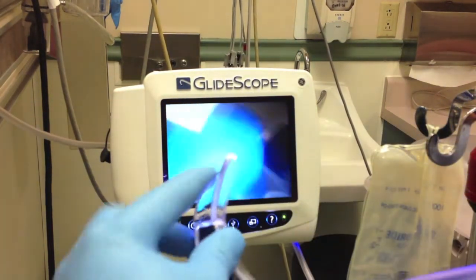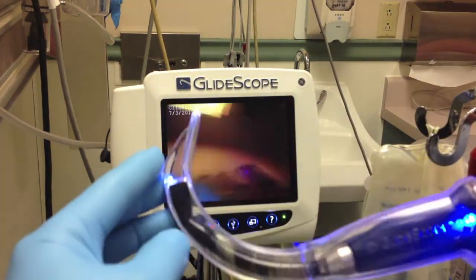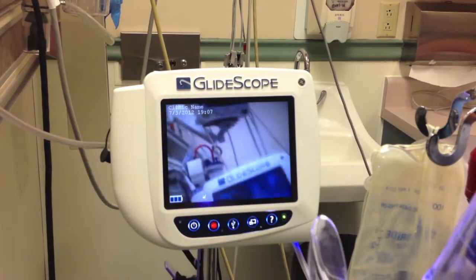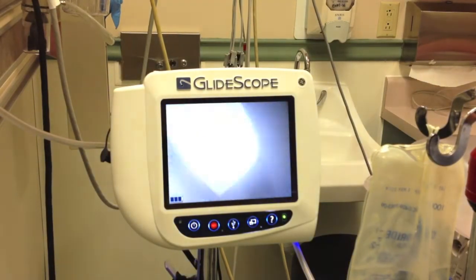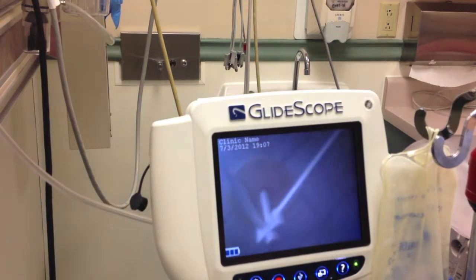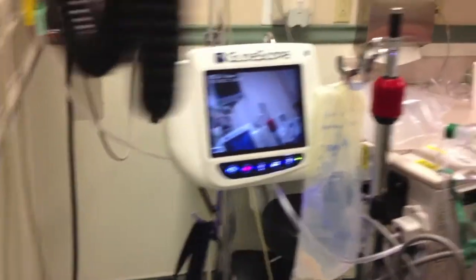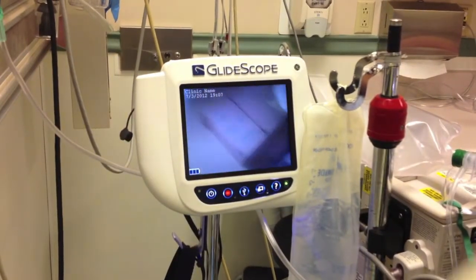The decision to do an elective intubation was made, so we had plenty of time to get ready and get the glidoscope. The glidoscope is a special instrument — an intubating laryngoscope with an attached camera. This allows not only the physician but everybody else to visualize as we're entering the patient's throat area, see the cords, and it's supposed to help the intubation, making it much easier.